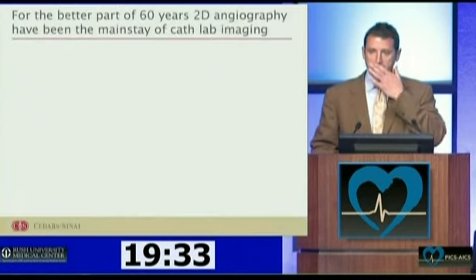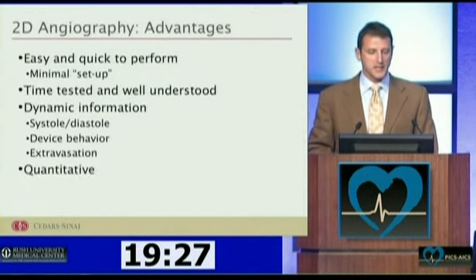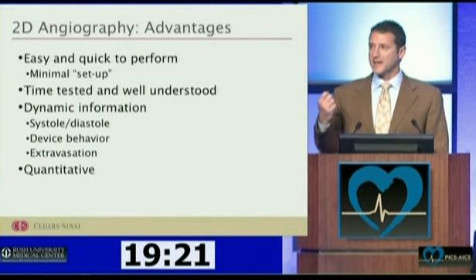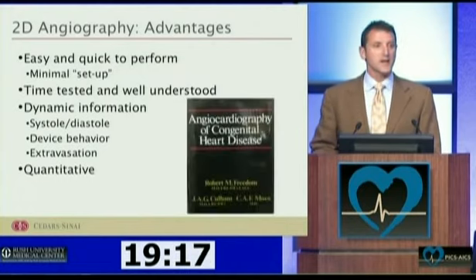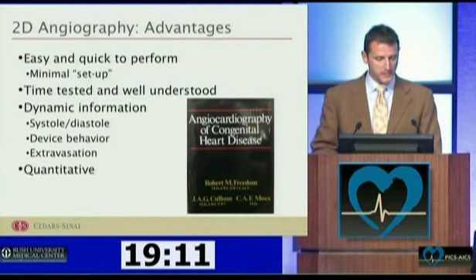Just real quick, and just to put this into some perspective, for the better part of 60 years, I think it's fair to say that 2D angio has been the mainstay of cath lab imaging, and let's not forget, there are numerous good things about two-dimensional angiography. It's quick, and it's easy, and there's virtually no setup. It's time-tested with some great textbooks. This is my personal favorite, for reasons many people understand, written by Bob Freedom.